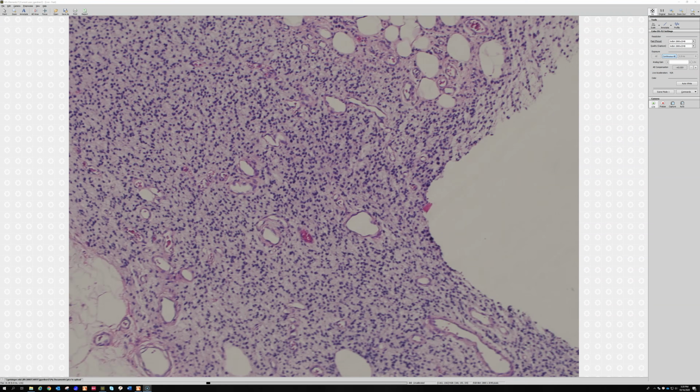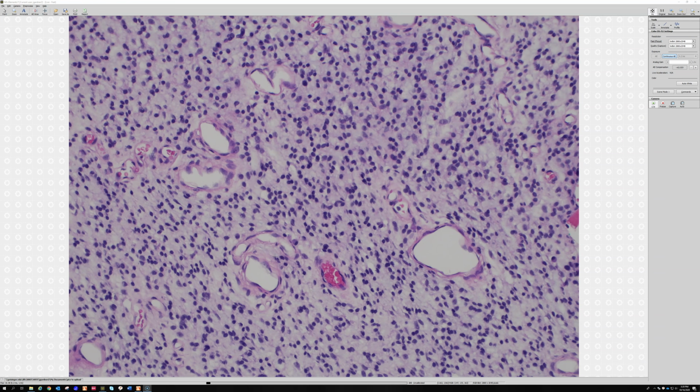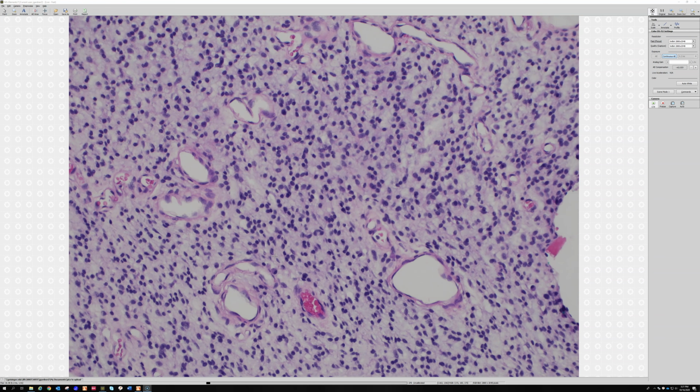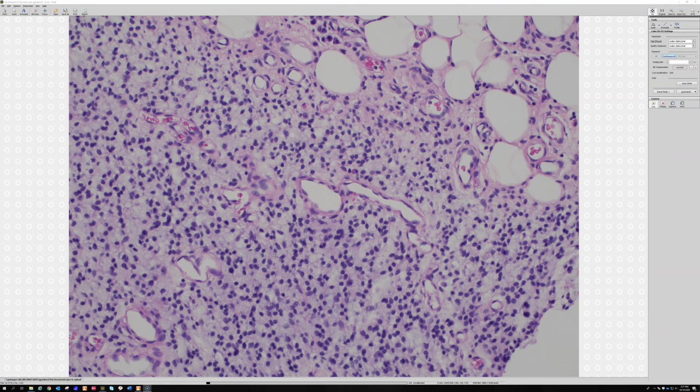So they can even start making you think about a round blue cell tumor, but they still are usually spaced out a little bit, and the cells are totally bland and have almost no mitotic figures. But just know that diffuse neurofibromas can have a rounded cell. And I remember the first time I saw this when I was in fellowship, I thought, how is this a neurofibroma? The cells are round. But in fact, that does happen, and it's a known thing. And this patient was also an NF1 patient, unfortunately.